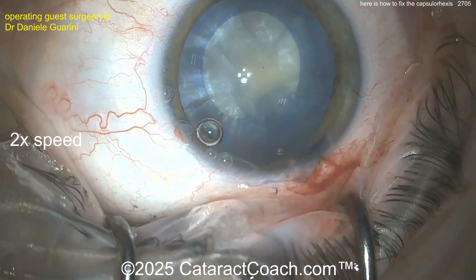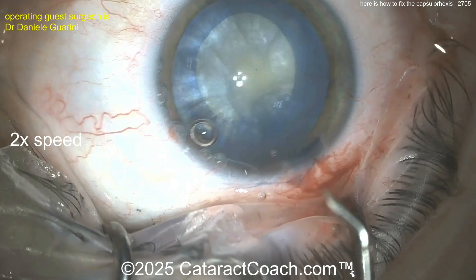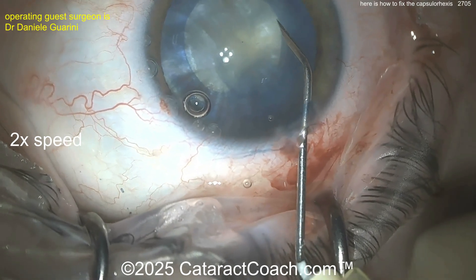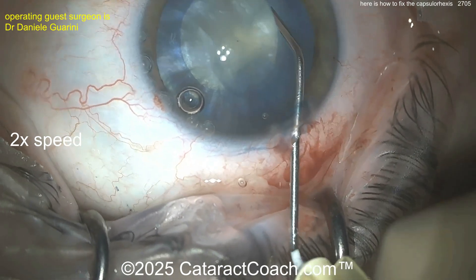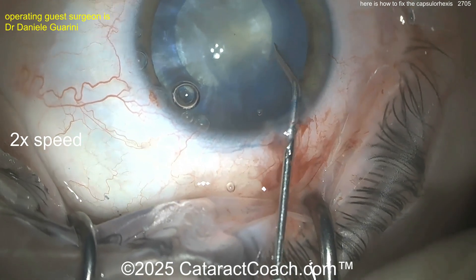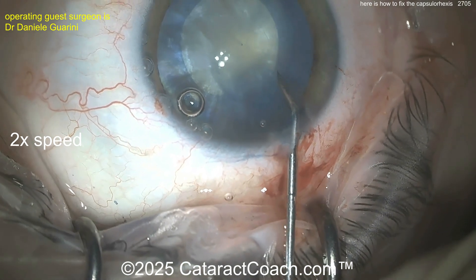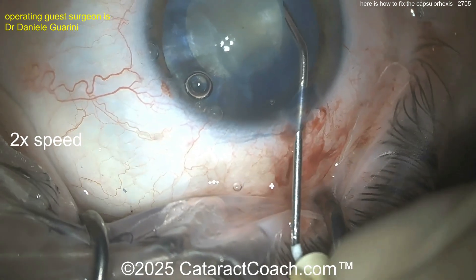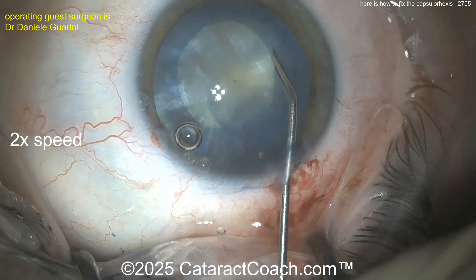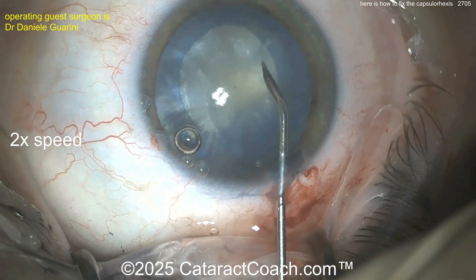Now let's see what we're going to do here. I just used a cystitome and barely nicked that lens capsule at about the three o'clock position in your view, right there. Someone's teaching you the right way — I like it. So here comes a cystitome or a sharp needle hitting the lens capsule right about there. Just a small nick is all you need. And then you're going to grab that — you're going to tear a little crescent. You can also use your micro scissors in there.